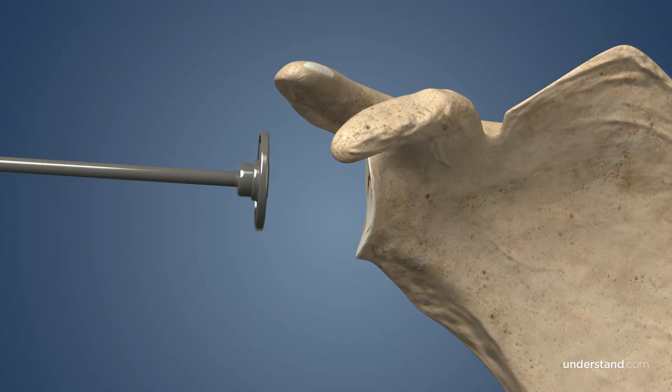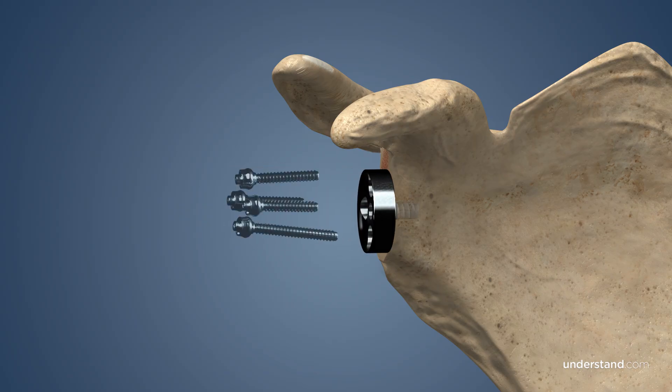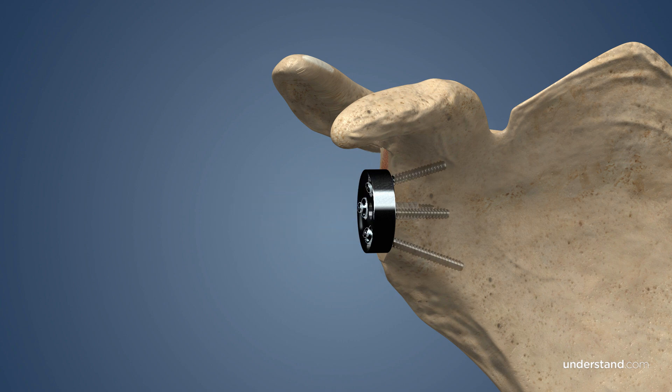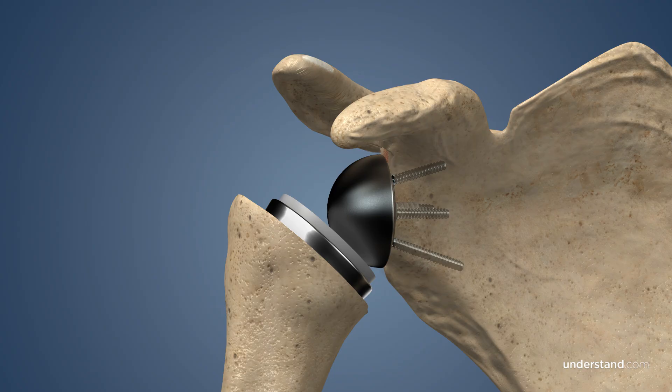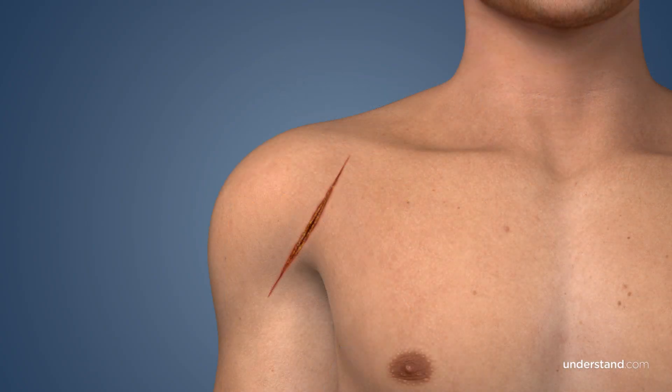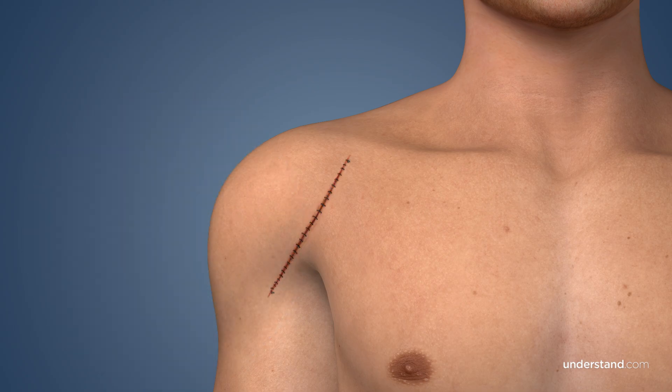Next, your surgeon will remove the damaged surface of the glenoid cavity. The first portion of the prosthesis is placed in the glenoid cavity and secured to the bone with screws. Next, the ball portion of the implant is affixed to the previously placed glenoid prosthesis, and the arm is rotated to place the ball into the socket. The incision is closed with internal sutures and either external sutures or staples. Finally, surgical tape or bandages will be placed over the incision.